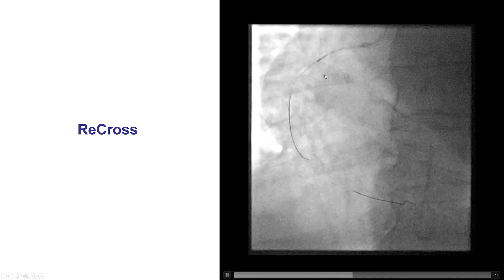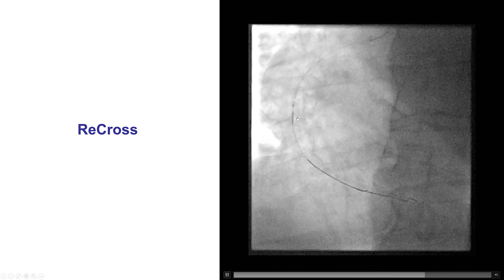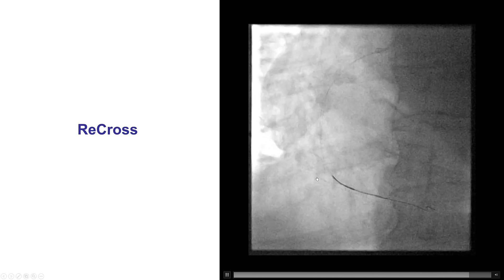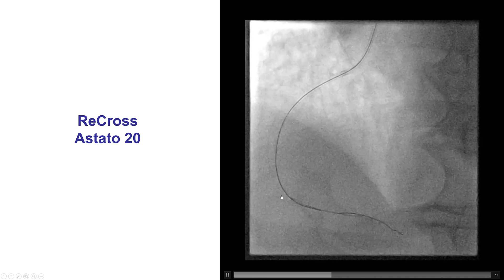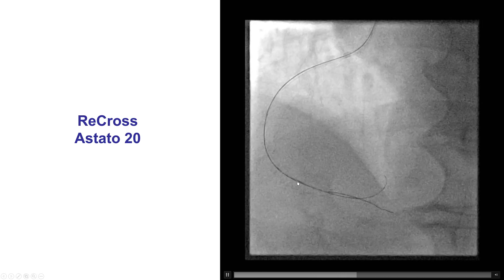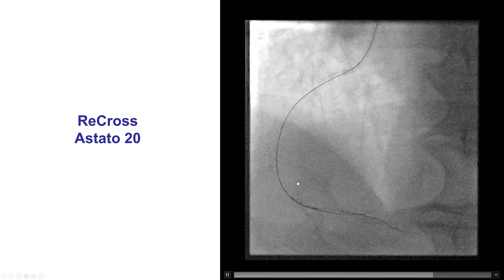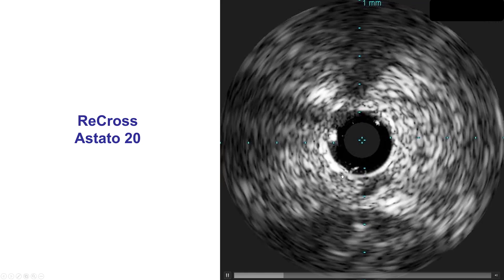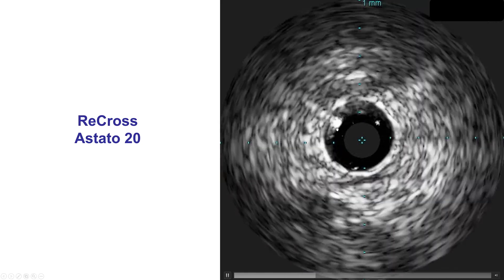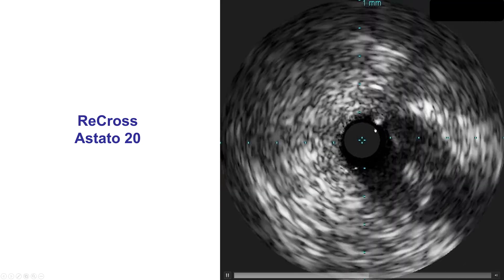We advanced the second guide wire, which went very easily distally in the dissection plane, along with an oval dual-lumen microcatheter, the Recross microcatheter. We then did attempts to reenter into the true lumen using one of the two lumens of the Recross, while aspirating through the other lumen in order to try to re-expand the vessel distally that had been collapsed from the dissection. Unfortunately, we were unable to actually enter the true lumen — we were still in the subintimal space, with the true lumen being compressed on the side of the vessel, as shown by intravascular ultrasound.